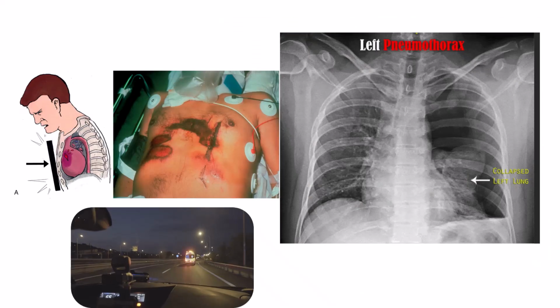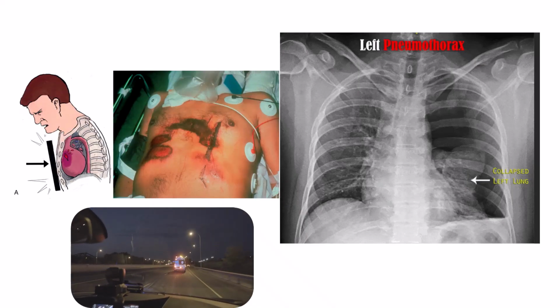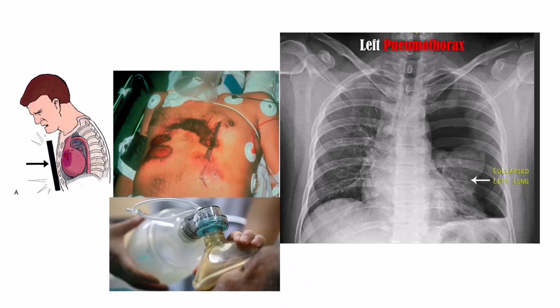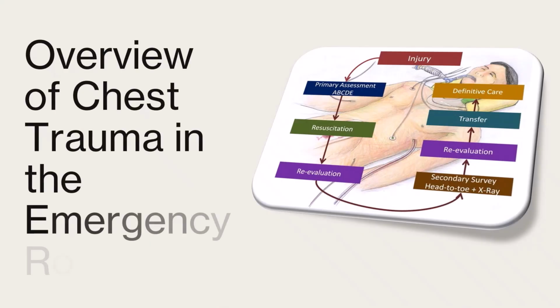To optimize trauma chest imaging in the ER, a radiographer must adapt standardized techniques to meet the demands and urgency of the current situation, the patient's instability, and diagnostic clarity. Chest trauma is a frequent and potentially life-threatening presentation in the ER. Understanding common causes and properly assessing patients on arrival is vital for timely diagnosis and management.